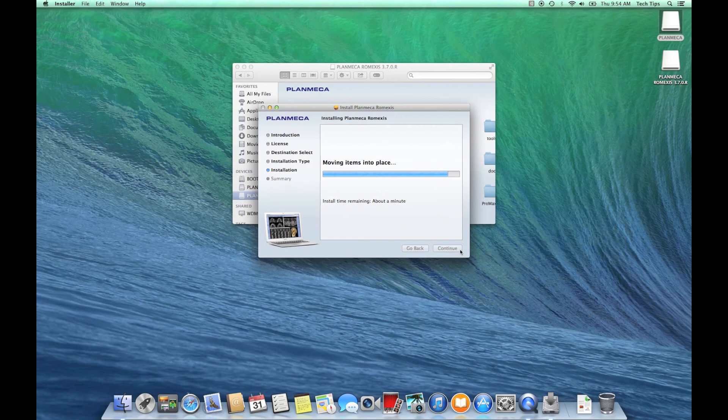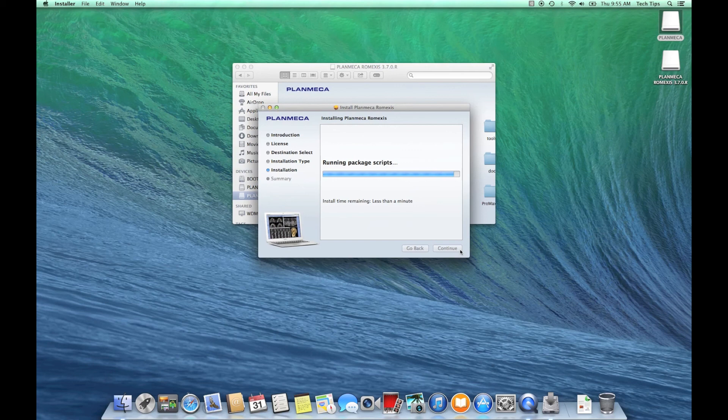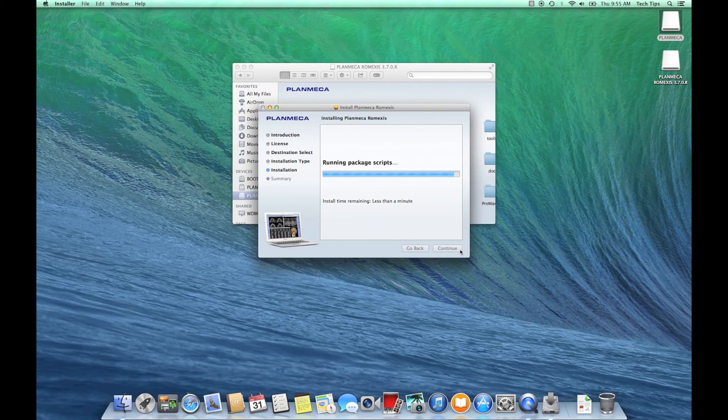The installation is wrapping up. As you can see it doesn't take that long, but once it's finished that's it - you've installed Romexis on a Mac computer. Go ahead and pat yourself on the back, it wasn't that hard.